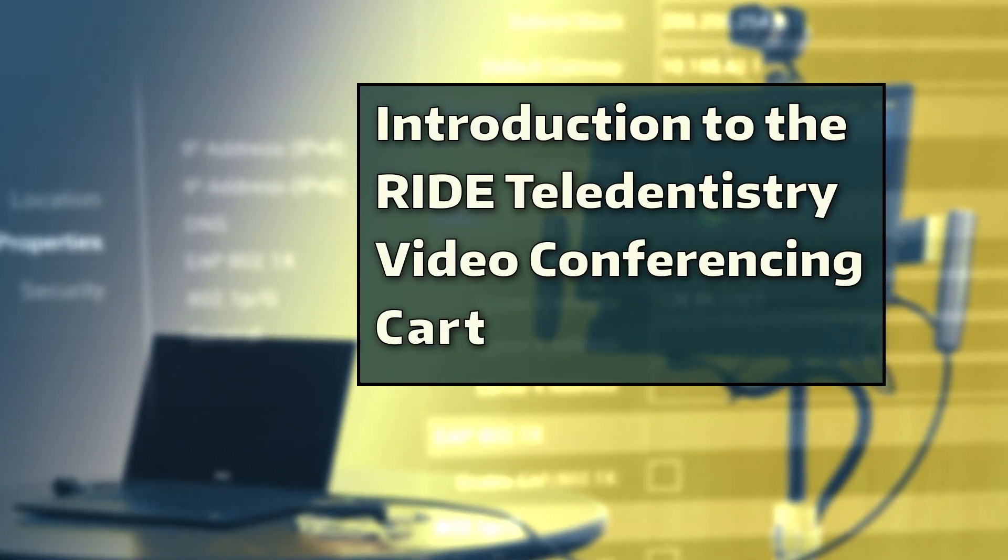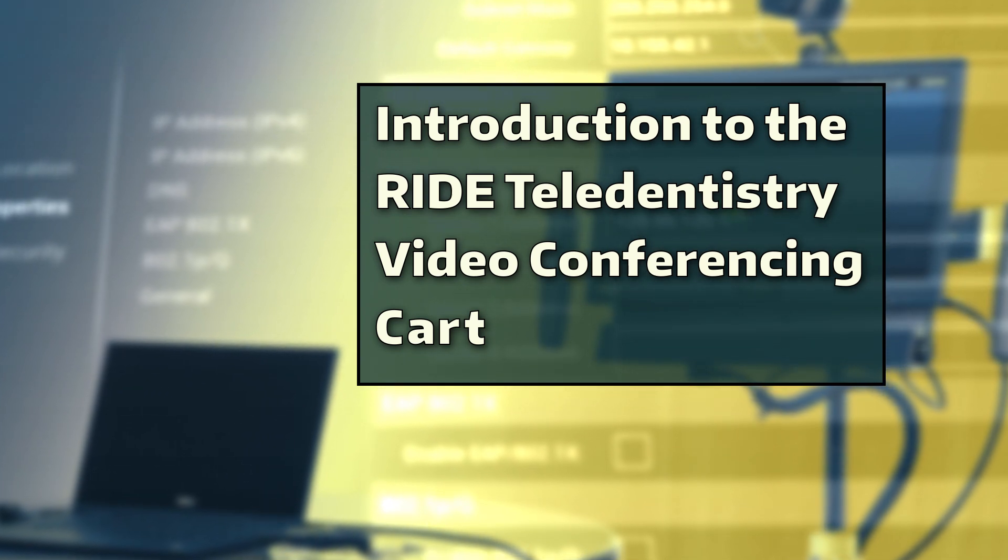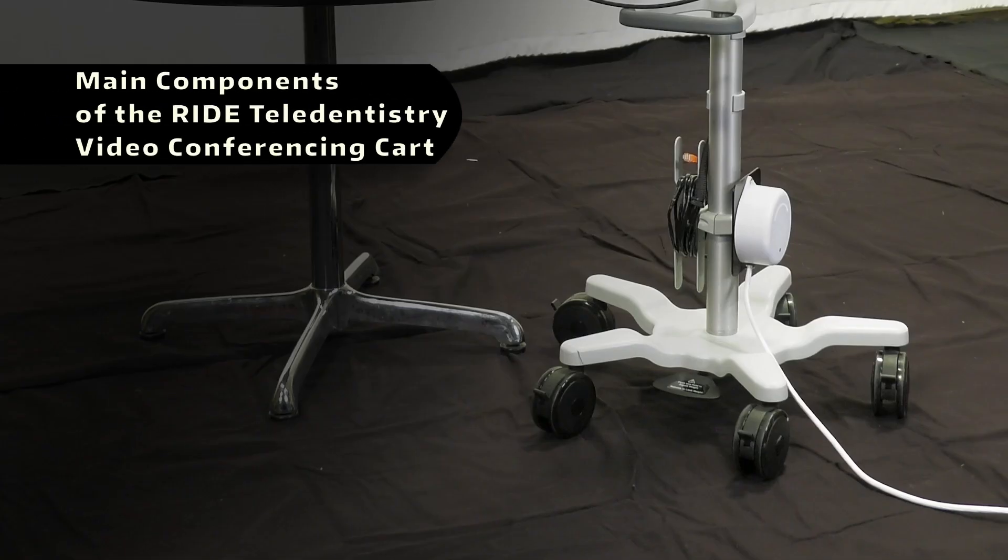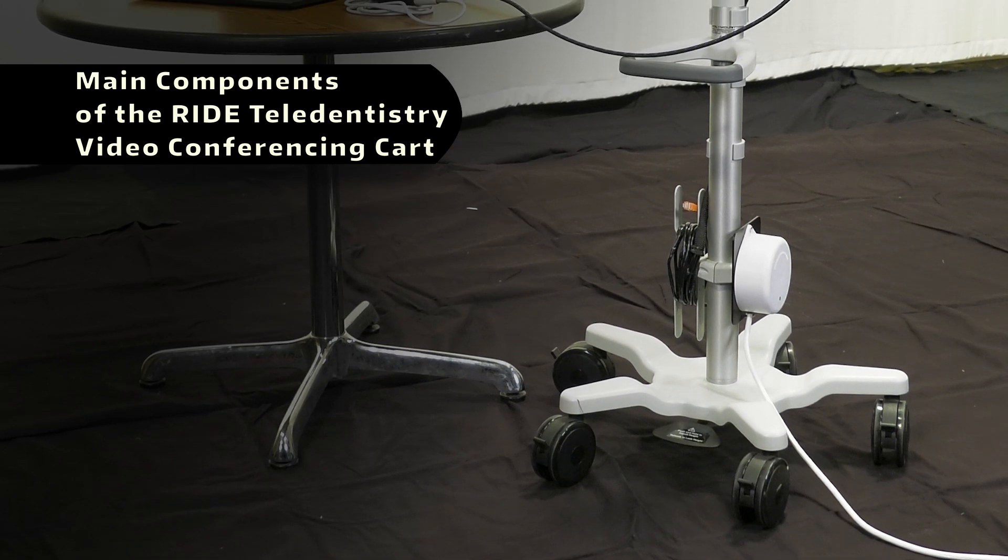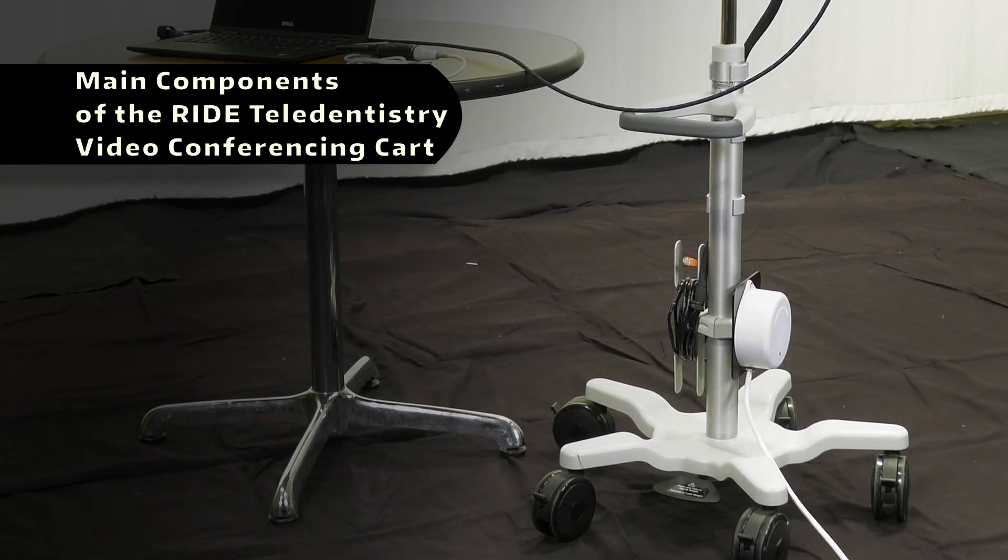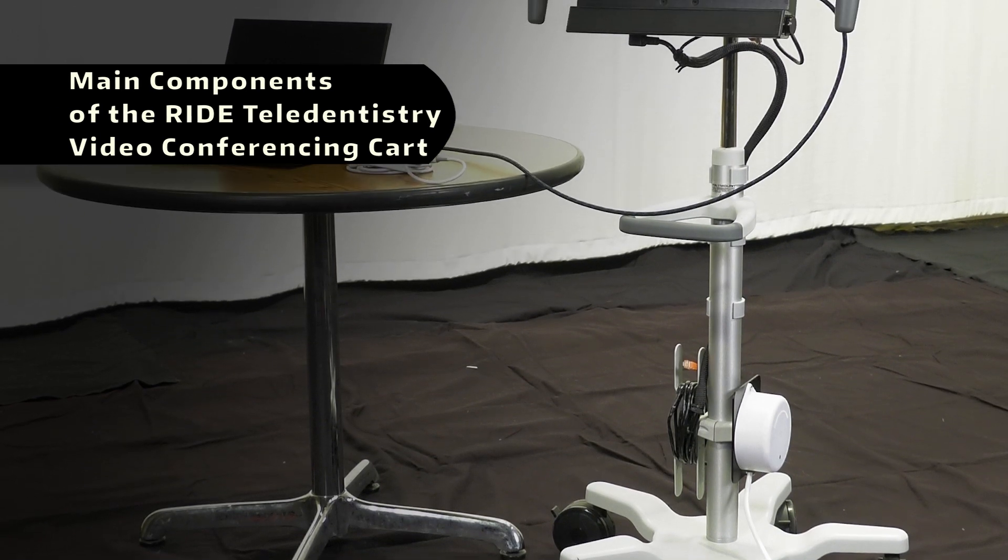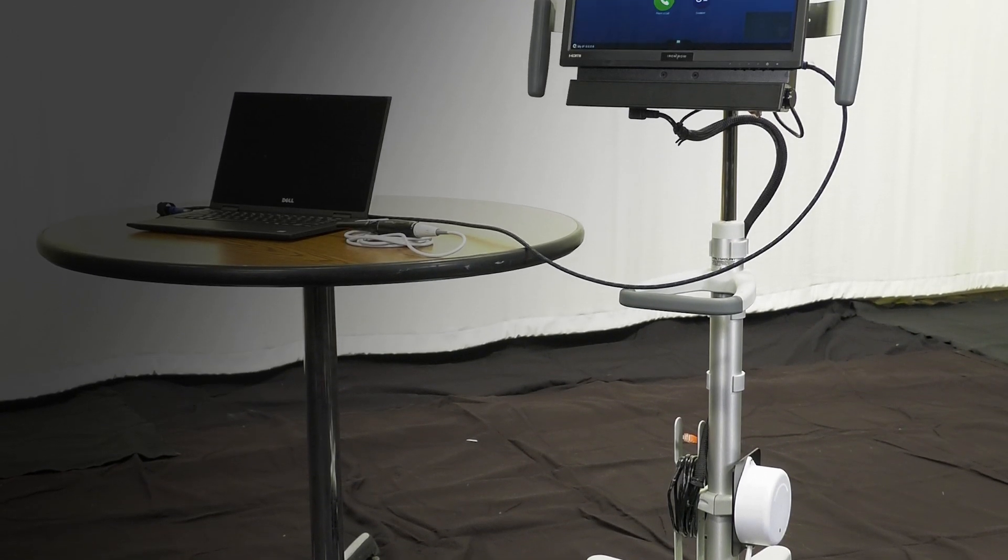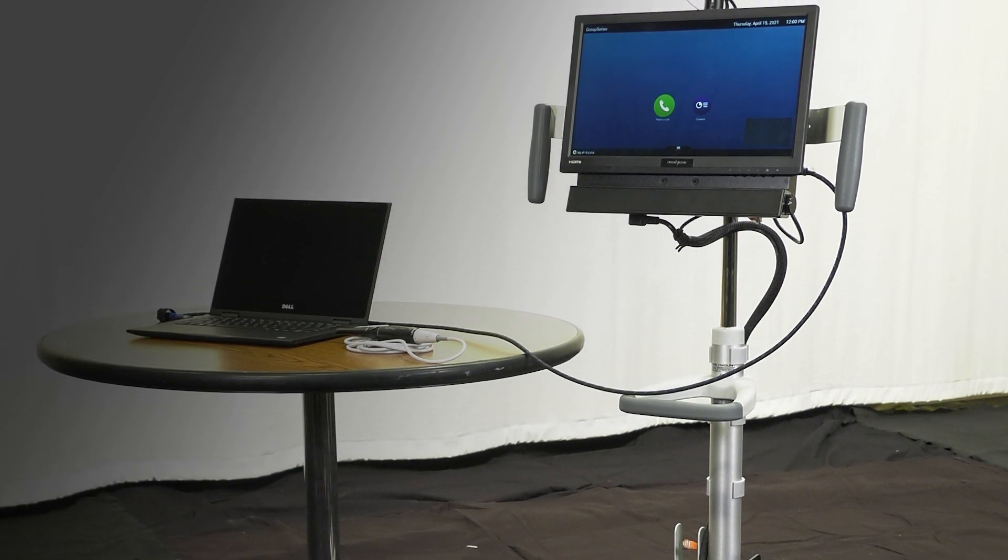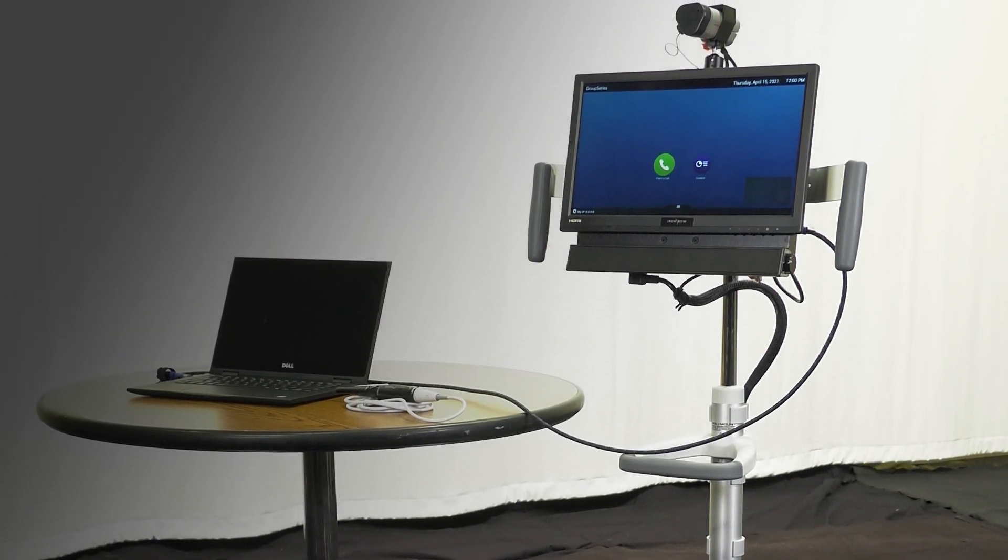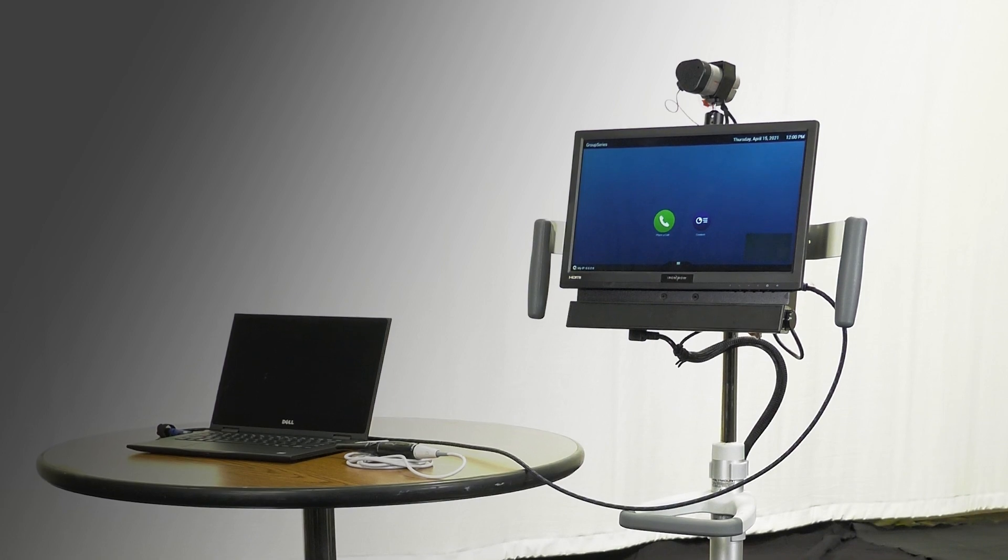Introduction to the RIDE Teledentistry Video Conferencing Cart. The Teledentistry Cart is a mobile teleconferencing unit that can bridge remote sites with the University of Washington School of Dentistry or other entities. Using its built-in telecommunication features, the cart can assist providers in the remote communication of dental healthcare training and service needs.